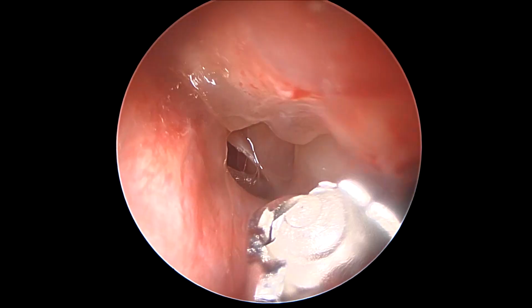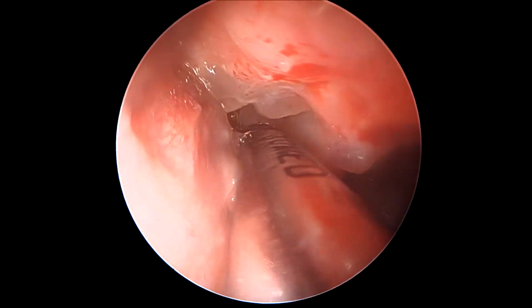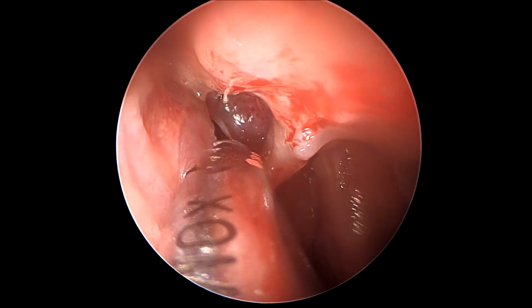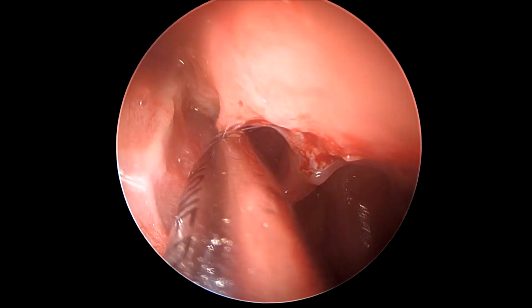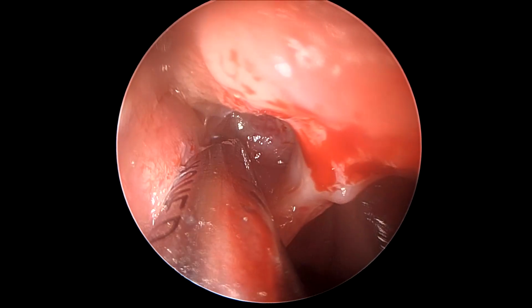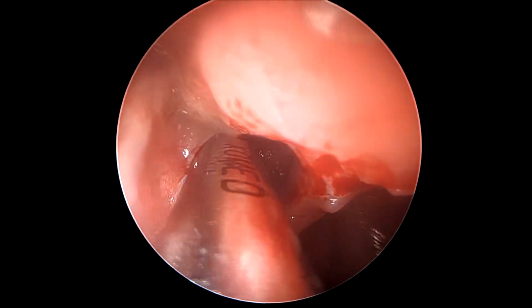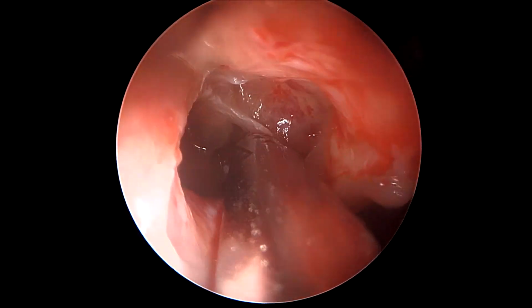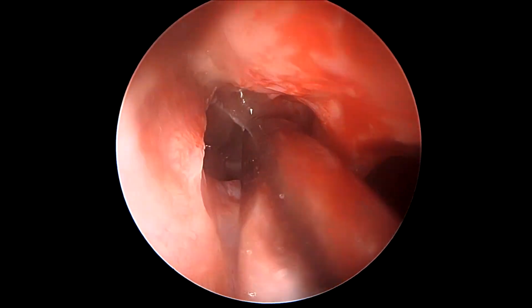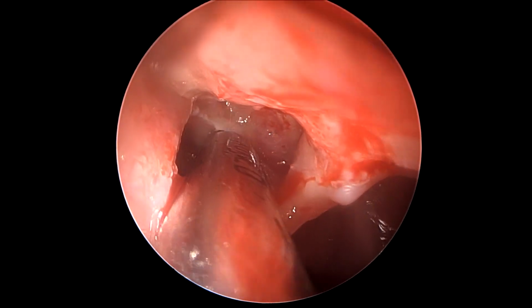So as we can see now, a lot of scar tissue or some polyps obliterates our ethmoid sinuses, which again need to be cleared. So following the antrostomy and the vertical and the horizontal antrostomy ridge, we take our shaver blade posteriorly to create the opening inside the ethmoid sinuses.